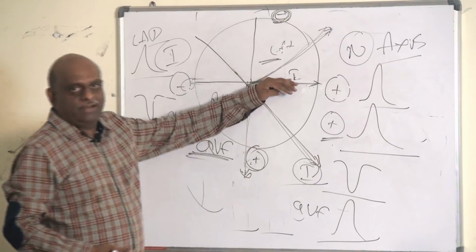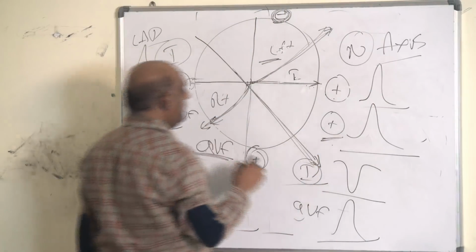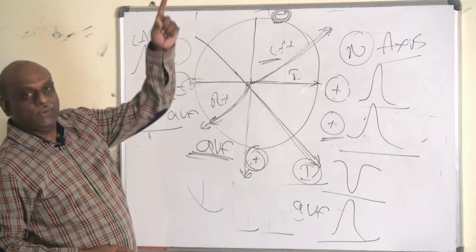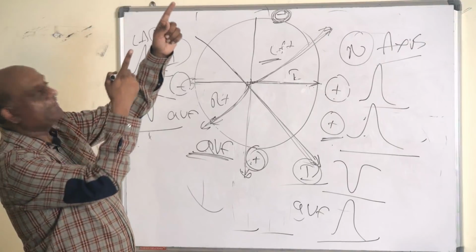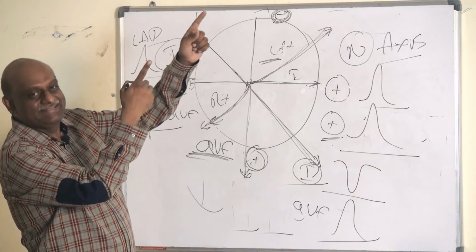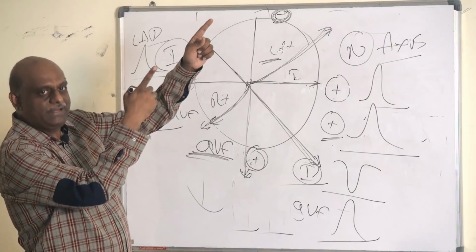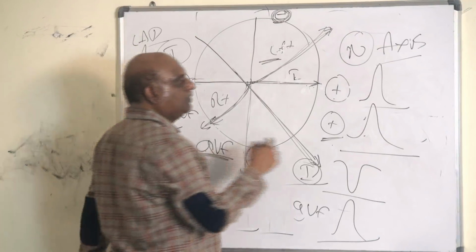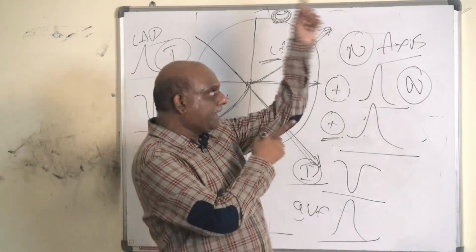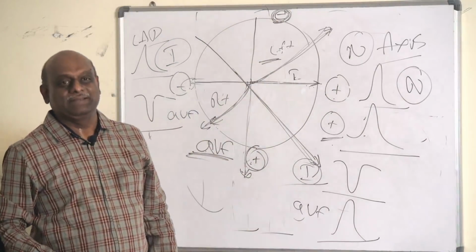If lead 1 QRS is positive, looking above, lead AVF is also looking above. The boy is looking up, the girl is looking up, both of them are looking towards whom? Arundhati Nakshatra. They are both getting married. Marriage is normal or abnormal? Absolutely. Supposed to be starting normal and later turn abnormal. So normal axis, typically lead 1 is looking up, lead AVF is also looking up.